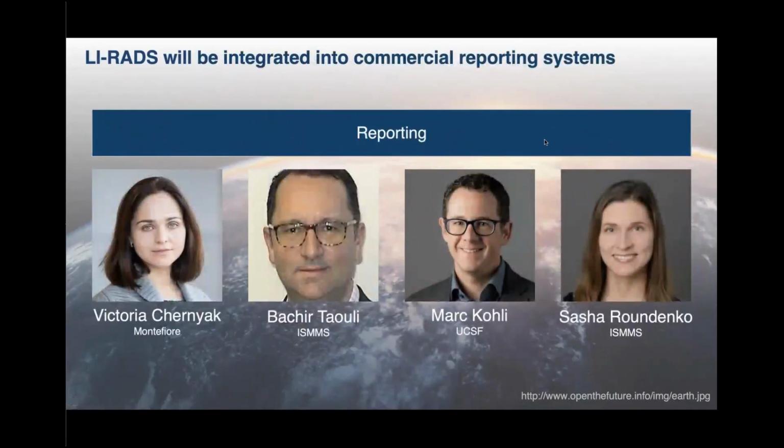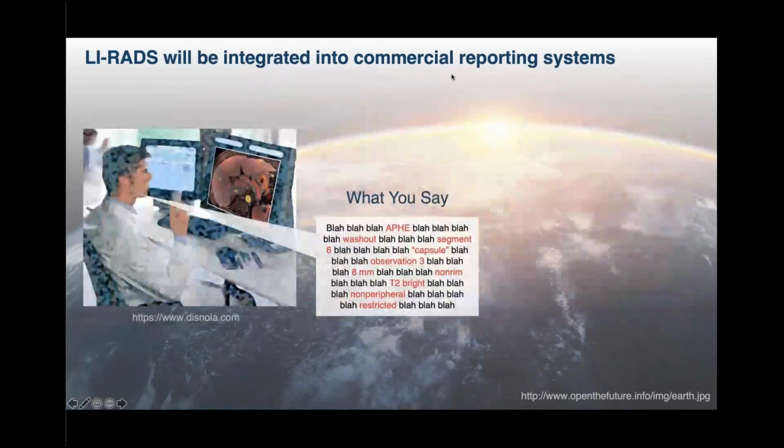We are also hoping that LI-RADS will be integrated into commercial reporting systems, and this is an important effort that's being led by some of the individuals shown on this slide. And our hope is that by integrating LI-RADS into commercial reporting systems, we will someday be able to describe into our dictation system the key terms, the standard terms that we need.